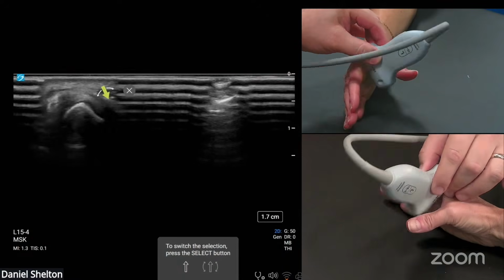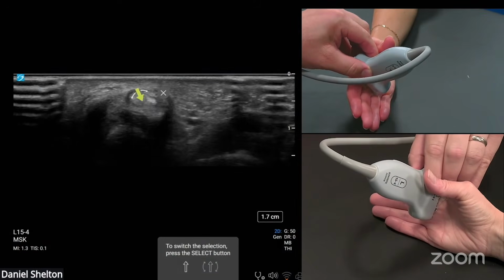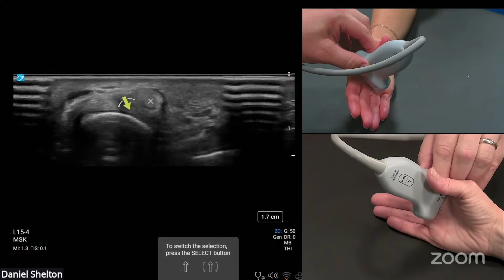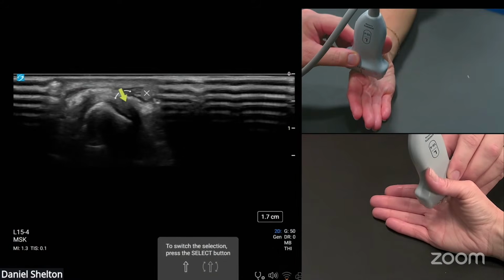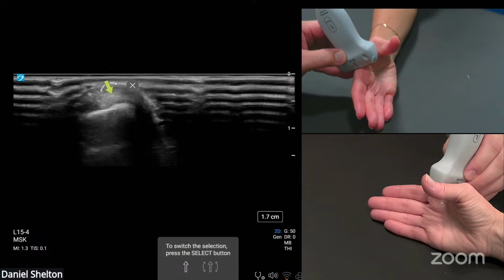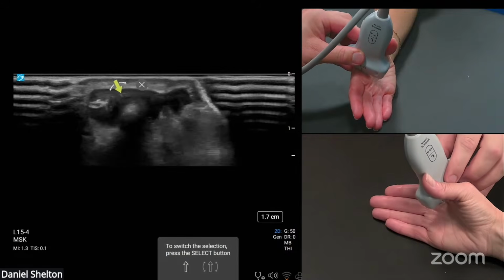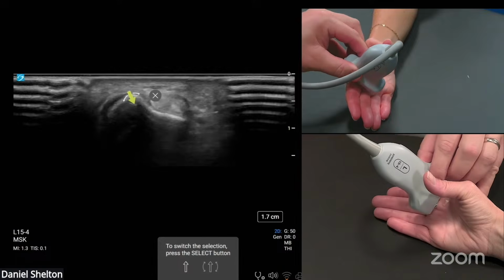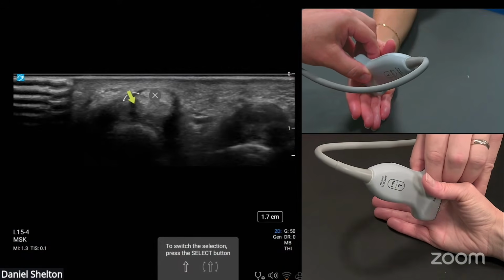So when you're on the palm and you're kind of wondering where volar plates come from, flexor tendon, superficialis and profundus, and on flexor tendon number 2, underneath it, we see palmar plate. So let's follow that palmar plate radially, and you can just see that relationship. Same group of fibers wraps around and becomes the accessory collateral. Now from the rest of the palmar plate here, if I go distally to the proximal phalanx where the palmar plate is also originating from, just that front lip or the proximal lip.